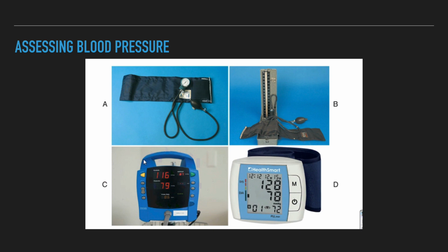The tubing and hand bulb in all sphygmomanometers must be free of cracks or holes, and connections must be airtight to prevent leaks that cause poor transmission of pressure and consequently inaccurate readings. To allow the operator to control the rate of deflation, the deflation valve must function smoothly.